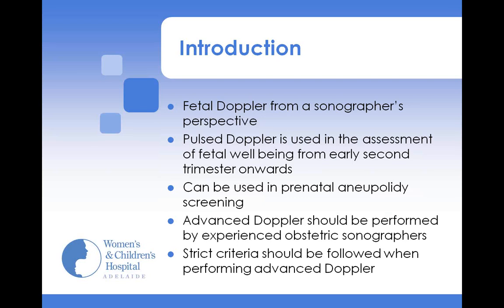So this is really a talk on fetal Doppler from a sonographer's perspective. Obviously, fetal Doppler is used in a clinical setting on evaluating the fetus. But from a technical point of view, as far as sonographers are concerned, that's what I'll be touching on today.